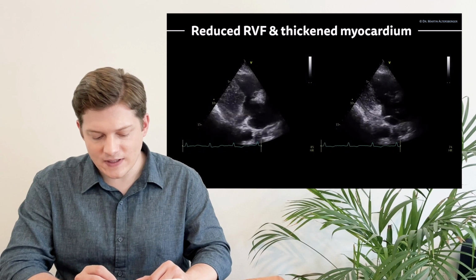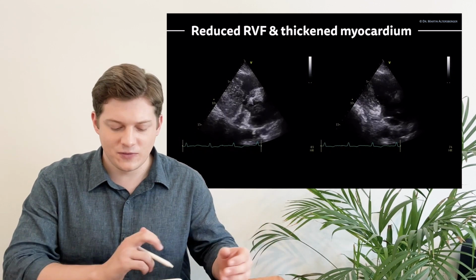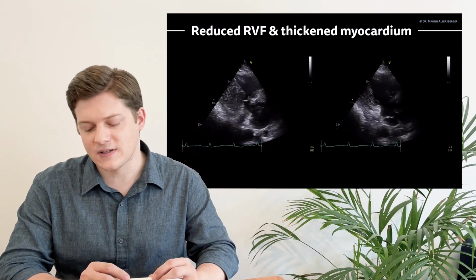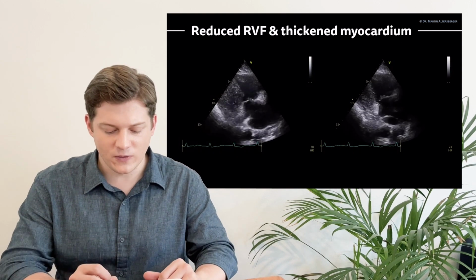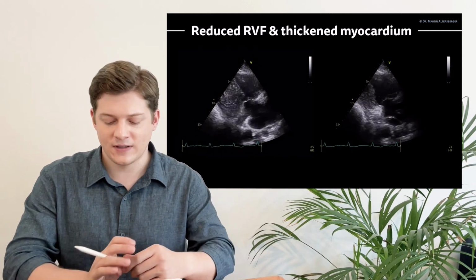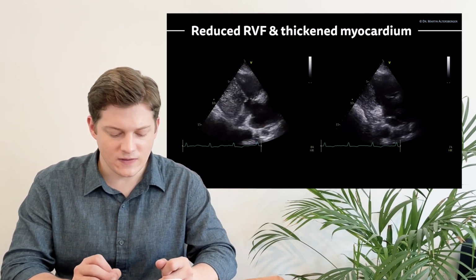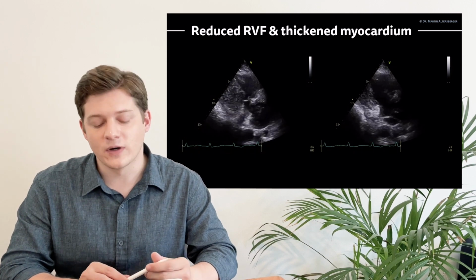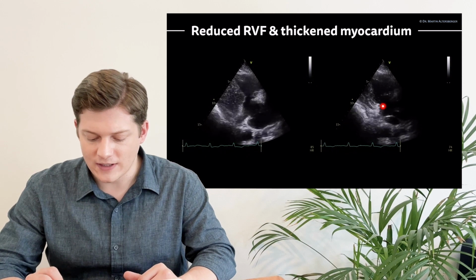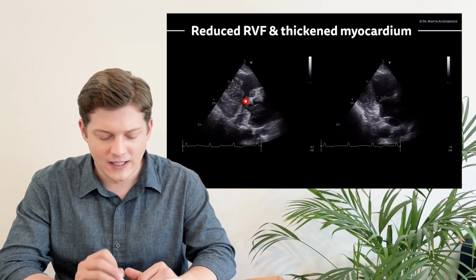In this view, you can see that the opening and the closing of the tricuspid valve is entirely different compared to a healthy individual, and you see that the inflow of the coronary sinus is more prominent. Also, the inflow of the IVC over here is more prominent compared to the healthy individual. This probably is the descending aorta, so this is the inflow, this is the coronary sinus. And both loops show that the anterior and the posterior leaflet of the tricuspid valve can be nicely differentiated.